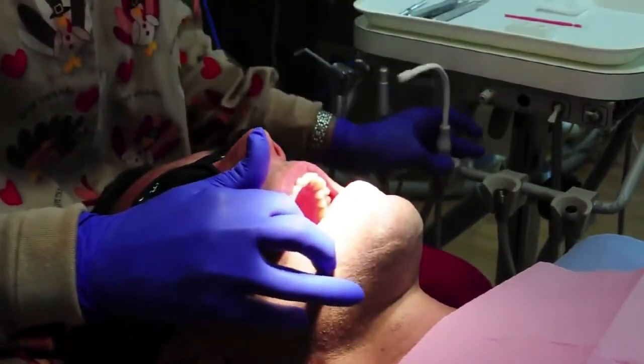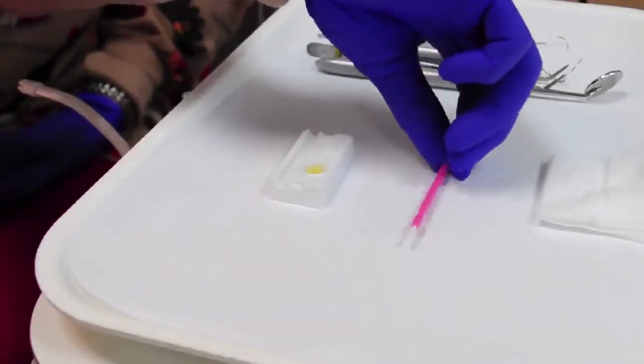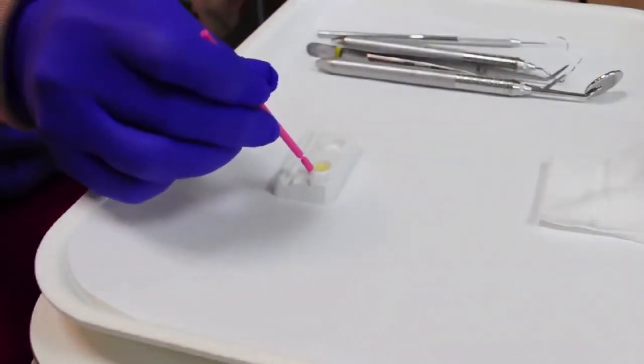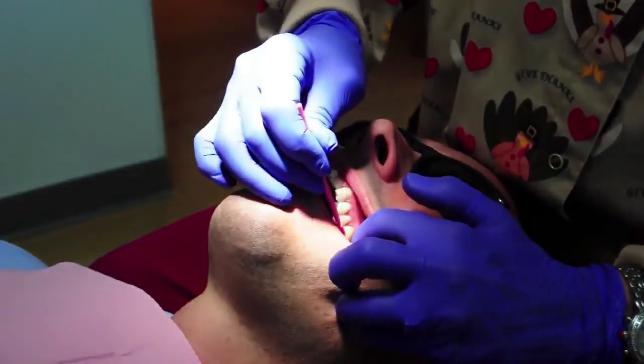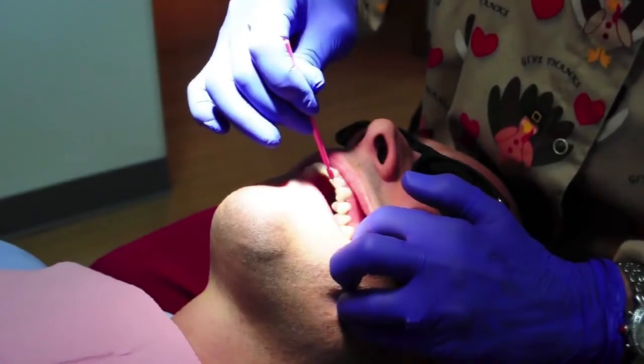Wet the provided brush with Floramax. Retract the cheek, and starting on the back molar of the upper arch, deliver the therapy in a single swipe to the central. Because Floramax is thin and chases moisture, it will spread. If you see white streaks, you've over-applied.